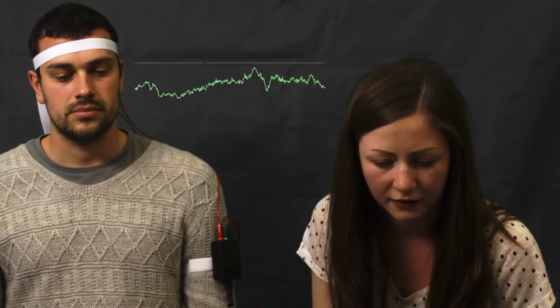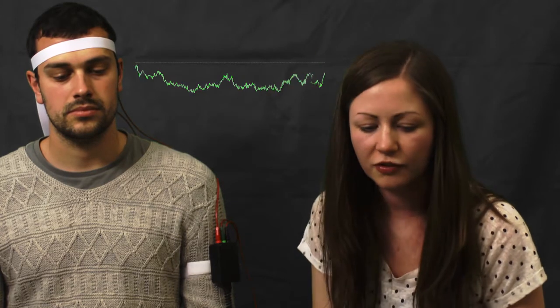Now, hopefully when we look at our recording we should see a signal. We're getting something now. So we're recording something, but how do we know it's EEG? As I mentioned before, recording from the visual cortex, if Jamie opens and shuts his eyes we should see a slightly different trace.